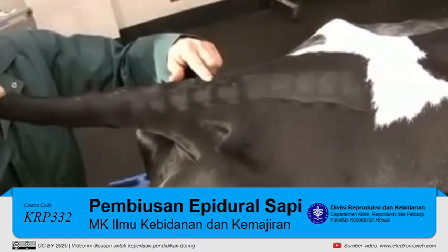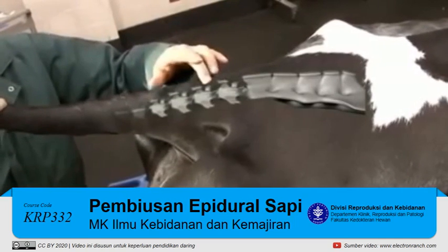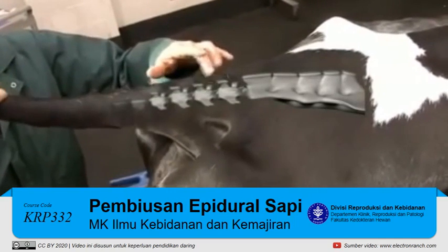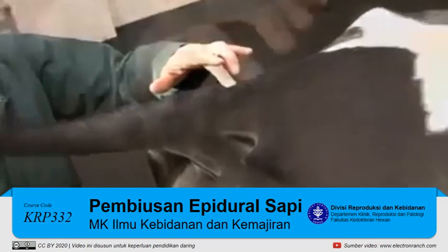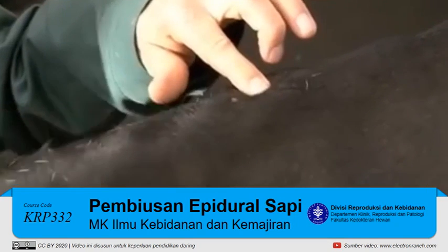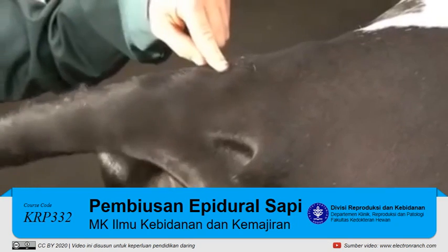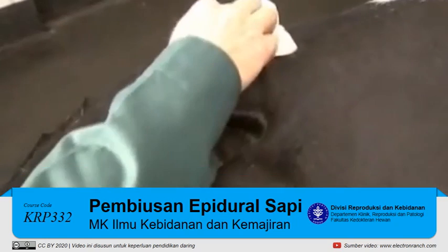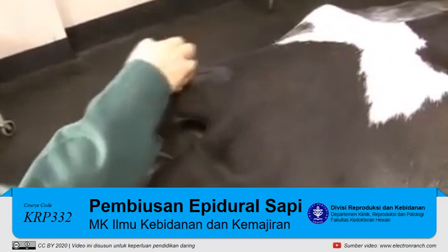This space is identified by gently lifting the tail up and down while simultaneously palpating for the first freely movable joint caudal to the sacrum. Once the proper site has been identified, the area should be clipped and surgically prepared.